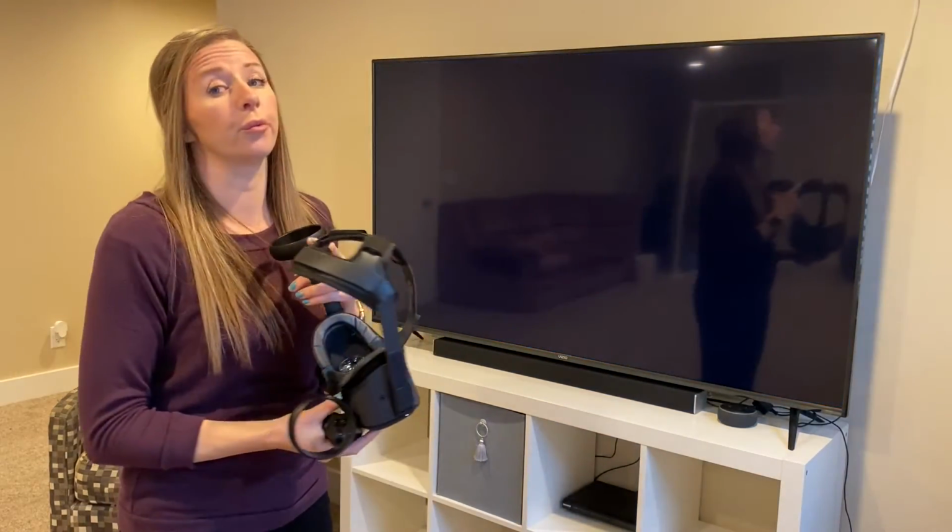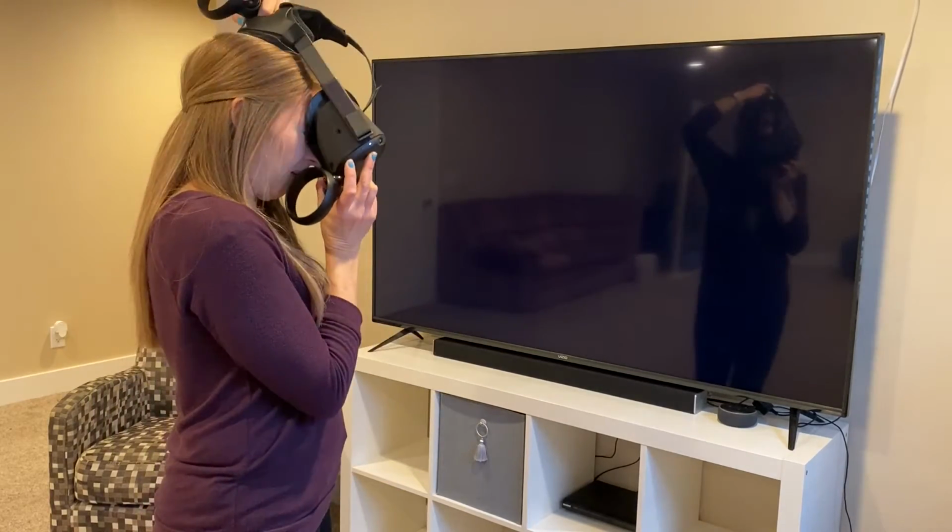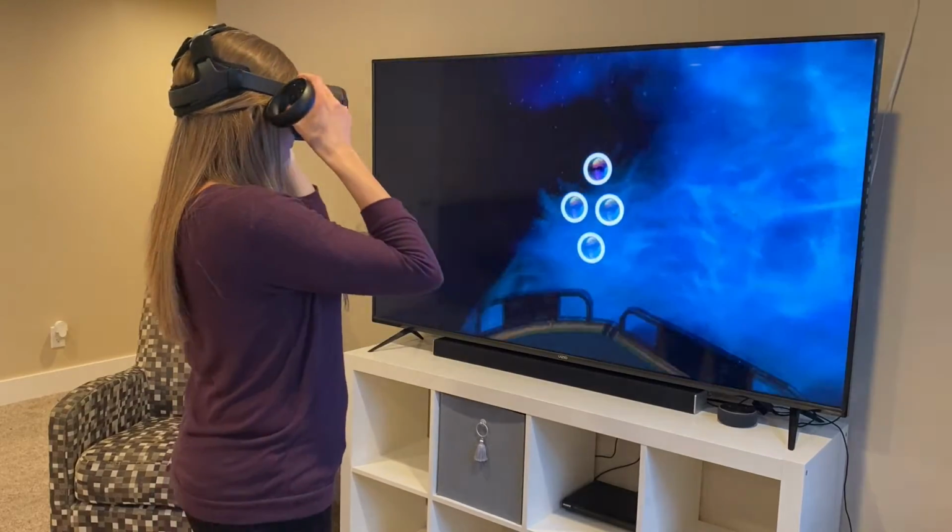So these ones are really, really good. They're a little boring, but so good for my brain. They make a really big difference.